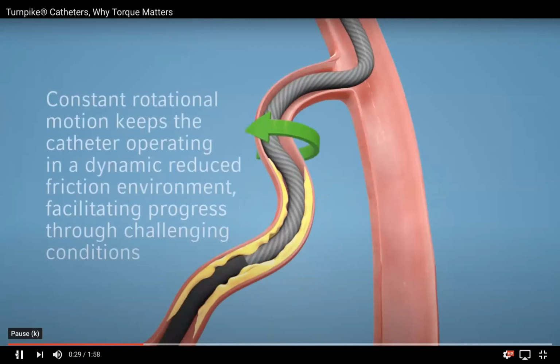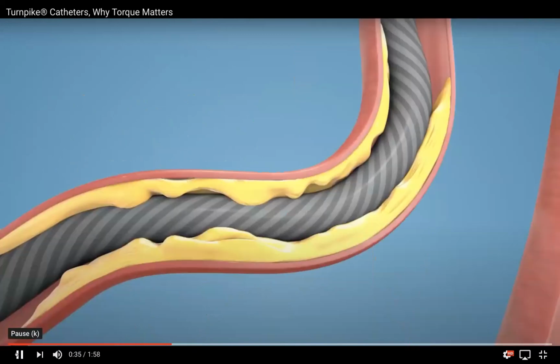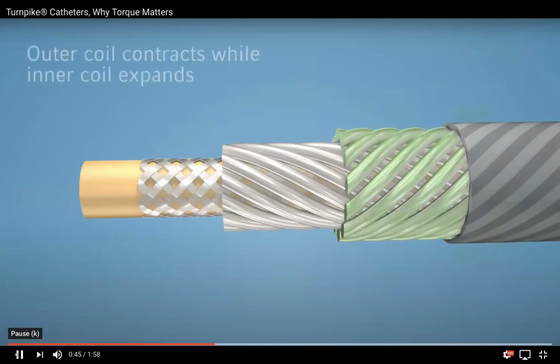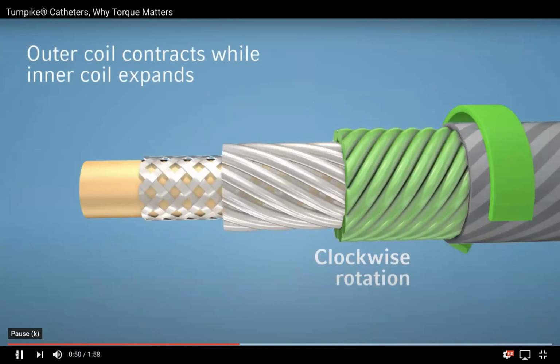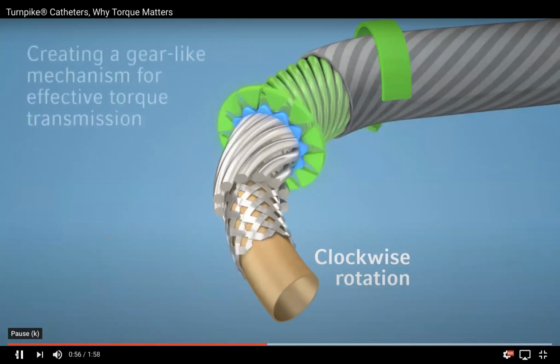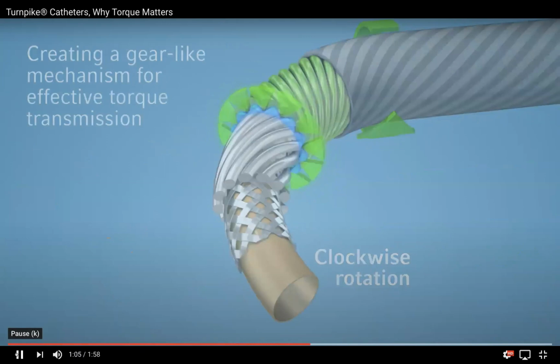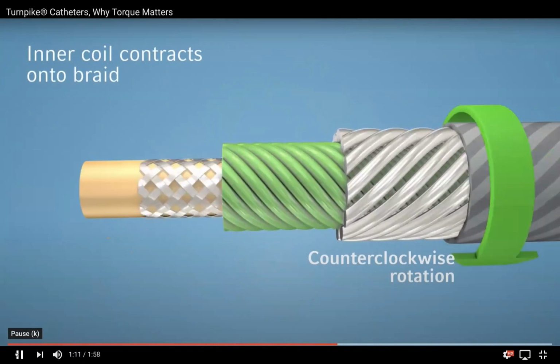It is an option, but the problem is that if you cause a dissection, that then becomes a relative contraindication to rotablation. That probably won't be a good idea, I think. I think that would probably be your last option if nothing else was working. But as we're being shown here, this microcatheter seems to be doing the trick. But then you have to do an ADR-like procedure if you're doing that balloon angioplasty, like you mentioned. No, because we've got the wire down the circ already, so it might be enough just to cause some small dissections at the proximal end, just to modify the lesion.